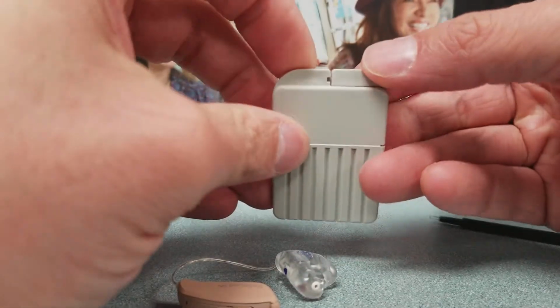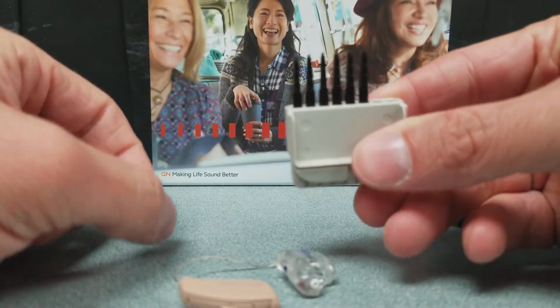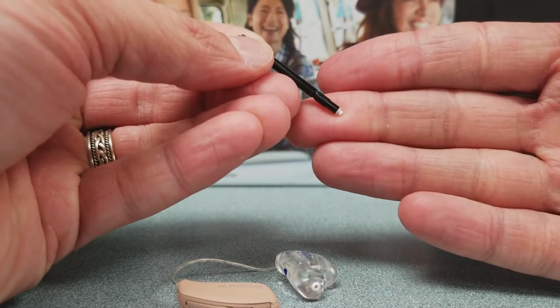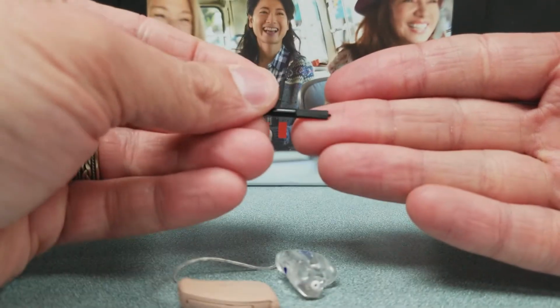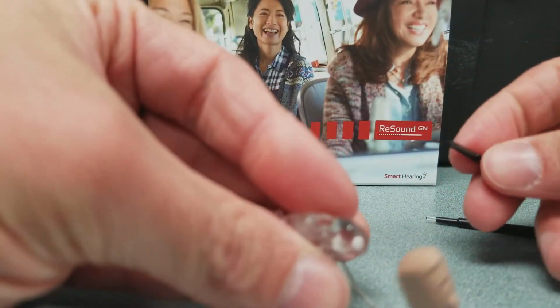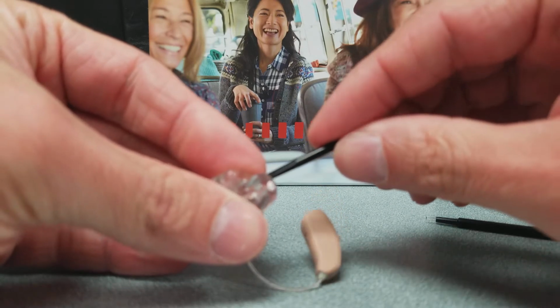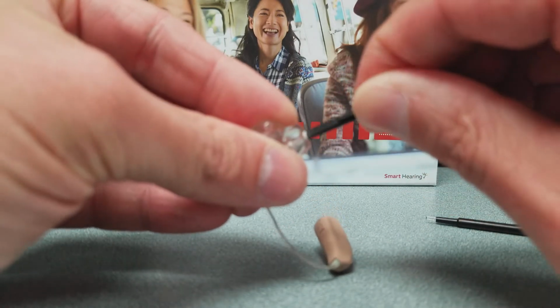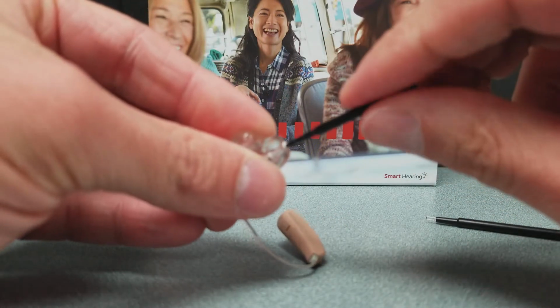To open this kit, you're going to push and pull the top. It exposes your wax guards. You're going to remove one. You're going to notice on one side there's a white tip, the other side has a black tip. You're going to start with the black tip first. You're going to screw it into the center of that wax guard, just like so, and screw it in. It's going to seat itself. You can then pull it out.